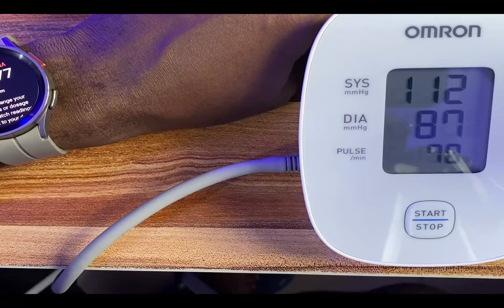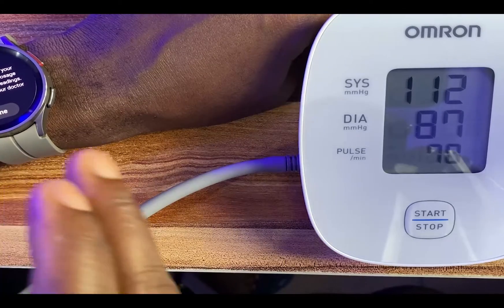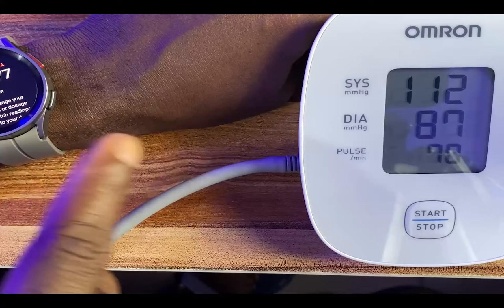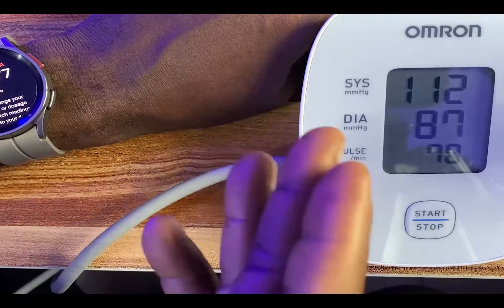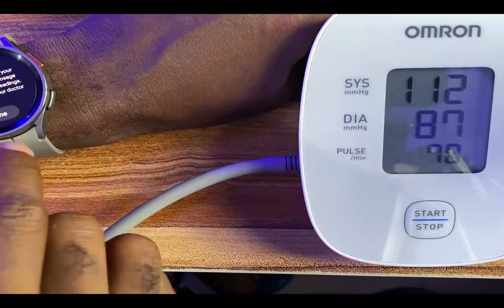I'm going to do this test again to see if we can have much closer results. Based on this, you can see that we have the same systolic, but the diastolic is a little bit different and the heart rate is almost the same. I'll just do this again.